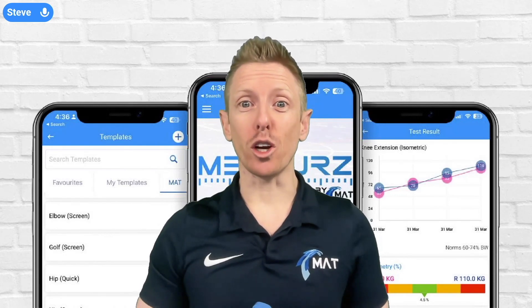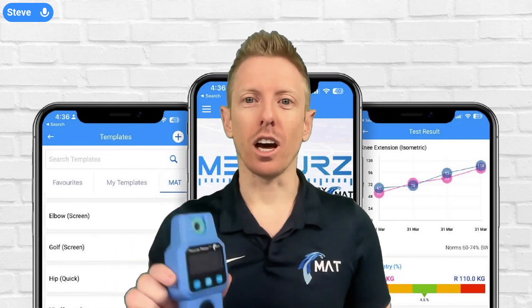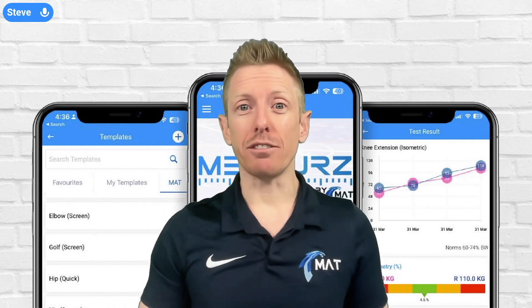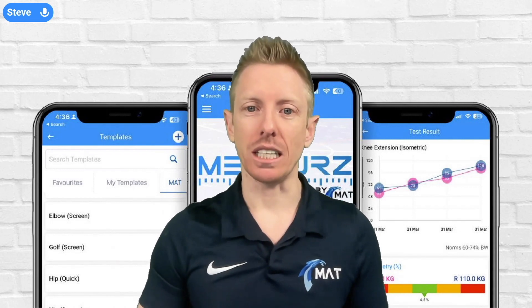I'm very excited in this video to be talking about the muscle meter, our push-pull grip strength dynamometer that you can pair up with your measures app to really get the most out of the device. In this video we're going to talk about the different features on the device, and in future videos we'll go through how you connect it up to the measures app.